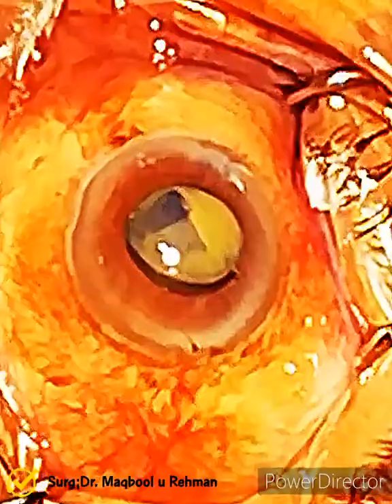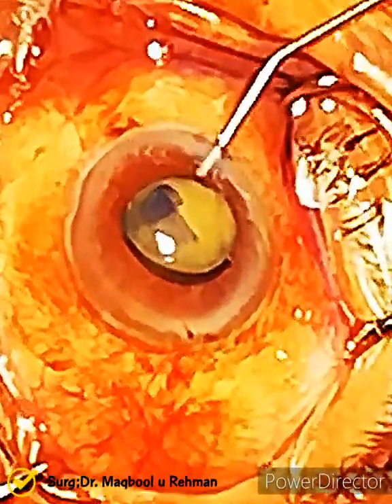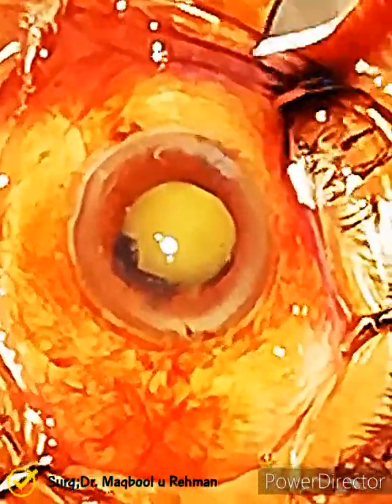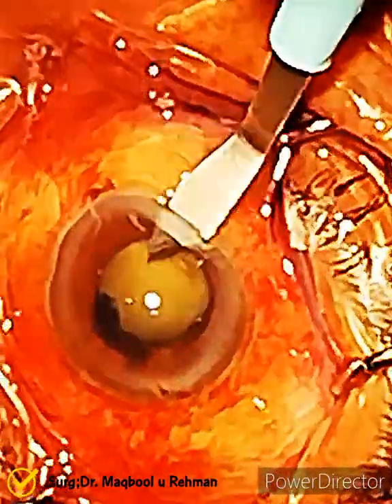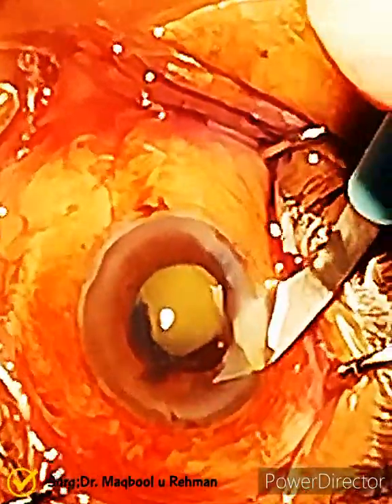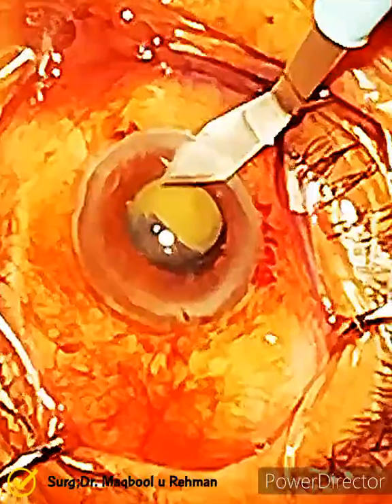I think he should remove the nucleus and then decide for the IOL. He is putting some more viscoelastic to deepen the anterior chamber. Look at the nucleus — it's very small. Using a 3.2 knife, extending the wound. This is the conventional extracapsular cataract extraction, which is now obsolete but sometimes done in special cases.